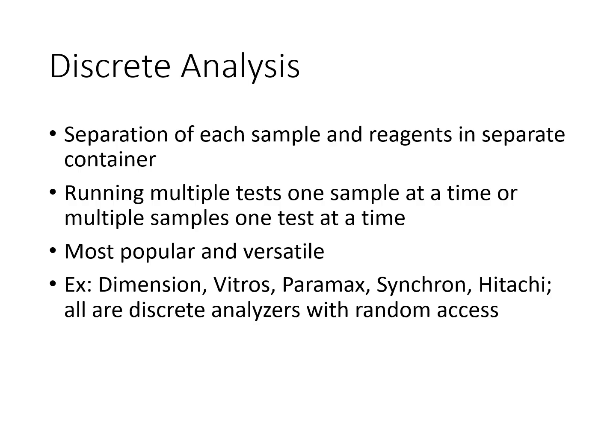So there is random access, and what this means is this method allows random access testing, which means that you can put on a stat sample at any time, and it would not interrupt the ongoing testing that's already going on. So some features of this: it is pretty popular and versatile in a lot of labs today. It supports a wide variety of tests and testing volumes. You may run into some of these when you're doing your clinicals.